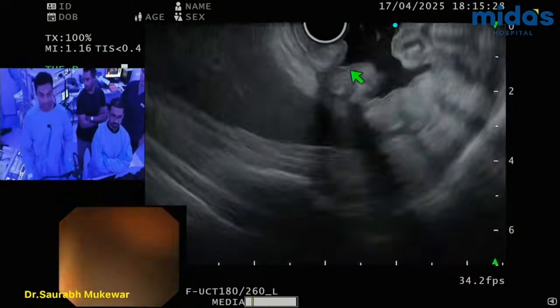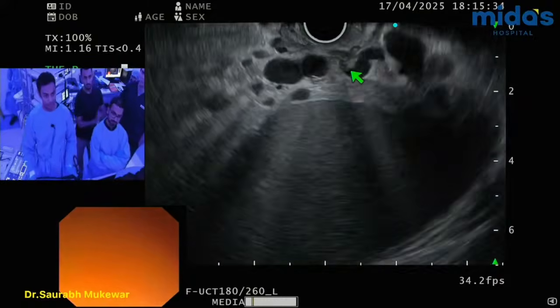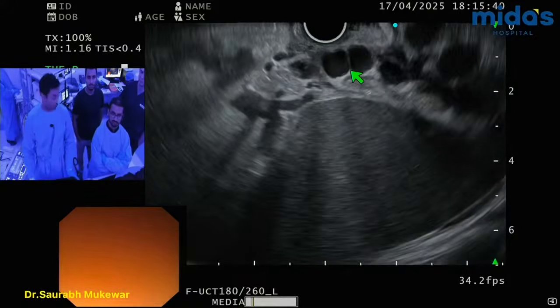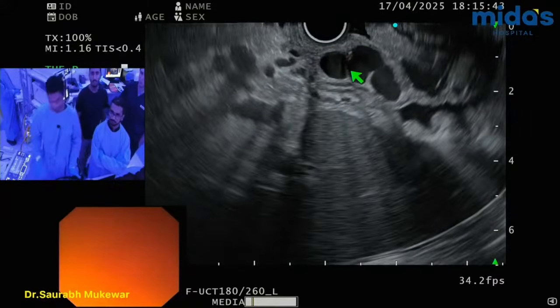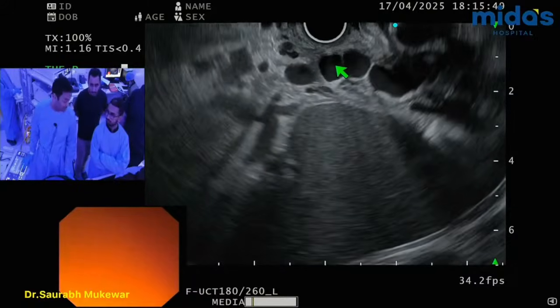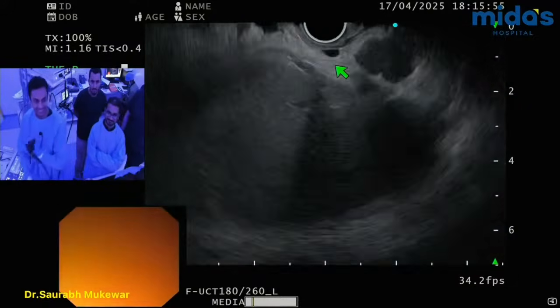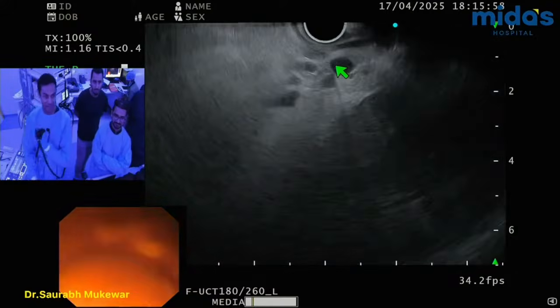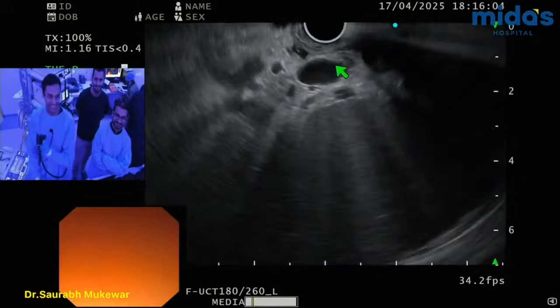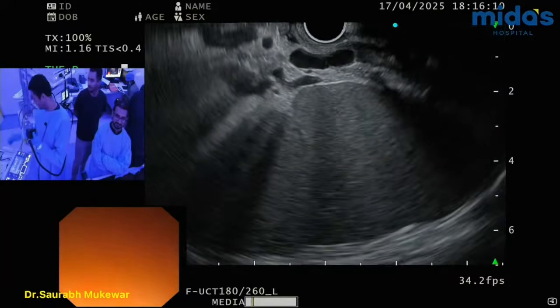Okay, can I get the needle? So the first thing I'm going to do is get into the, yeah, right this. So what I'm almost going to guarantee you is that when you put the needle here and inject, it's going to go here. So that means you've done the right thing. I'm happy to have a bet on this one. Anybody want to bet? No, I can be wrong, man. All right, let's see. Okay, can I have the 10 mm coil?